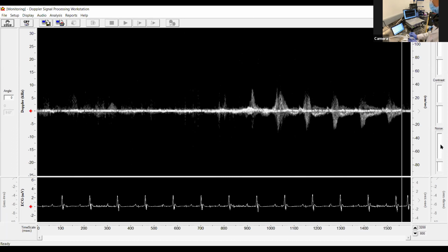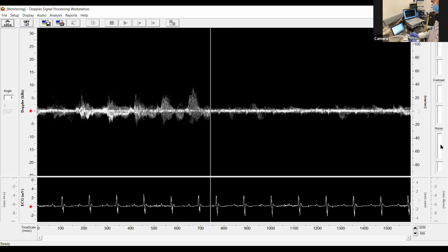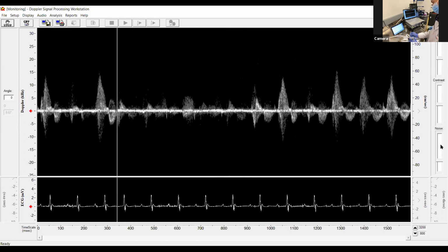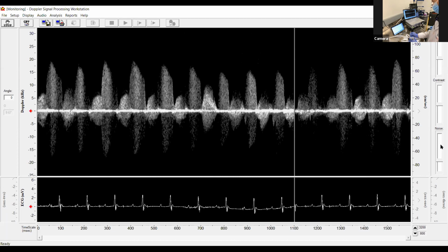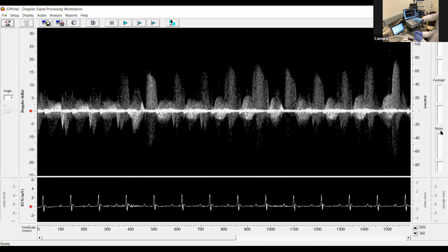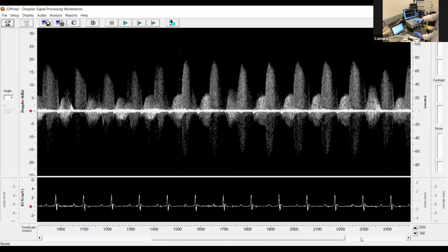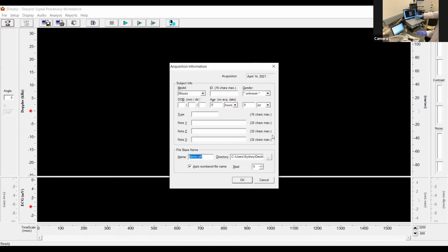But I think what I'm actually seeing is mitral flow based on where you are, with a lower E than A peak. So what we saw as the reverse of what we expected on both the first and this mouse, I think is actually, there's a phenomenal coronary artery, sorry. That is a fantastic coronary artery view. Of course, she's taking the same approach. And if you know the anatomy, that's fantastic. So very nice strong peak velocity with that very characteristic appearance. And then we see where it sits within the ECG signal. So we know it is in fact happening during diastole. So as we go, we'll point out the signals that we see.